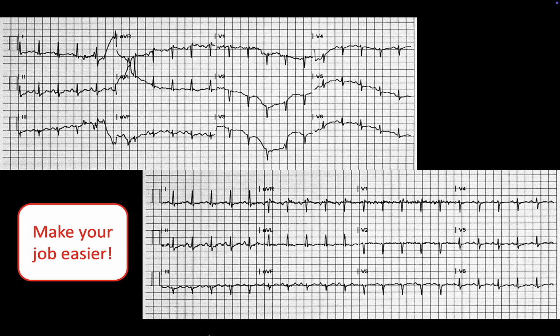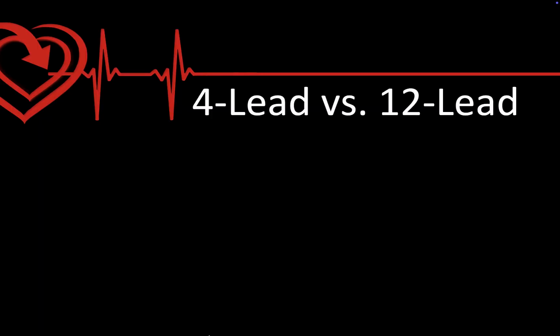The first one, any movement, breathing, anything creates a baseline that is really not helpful for interpretation. This is why we have patients hold still, lay perfectly still for the 12 to 15 seconds while we're acquiring that 12 lead tracing. Couple things on the monitoring themselves.